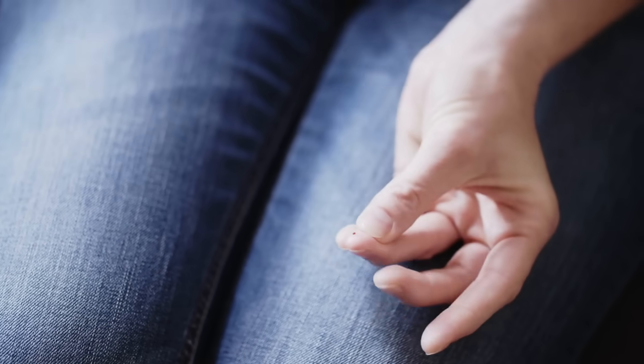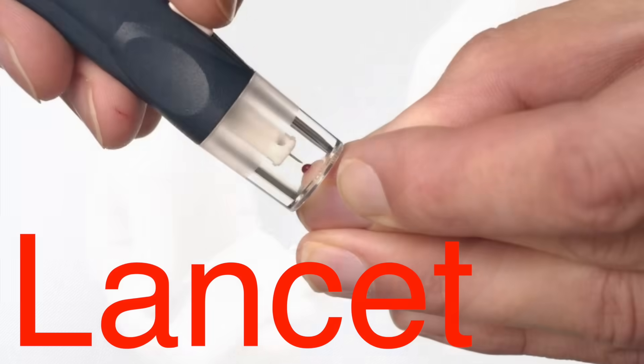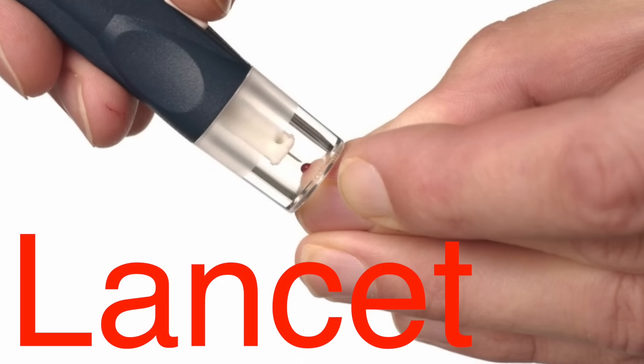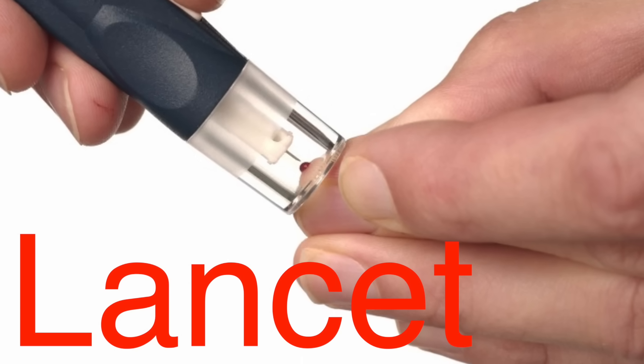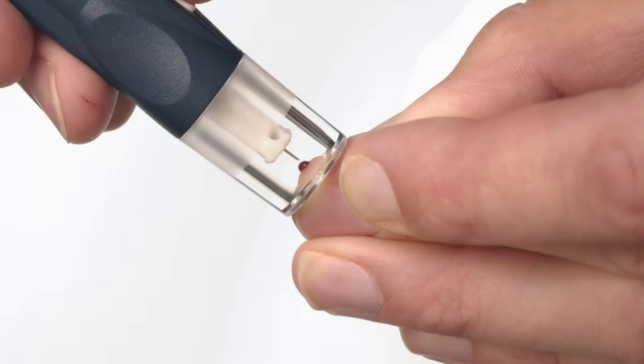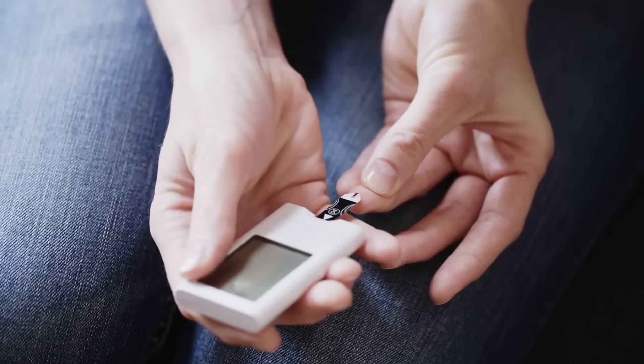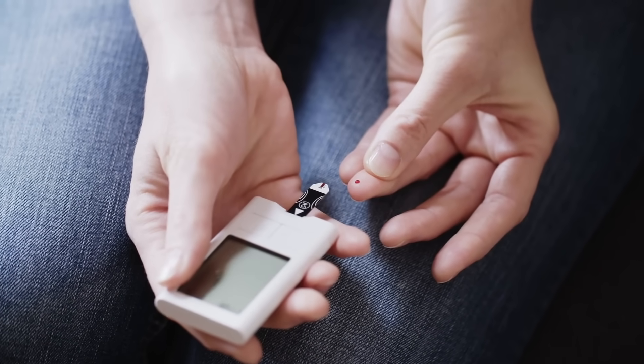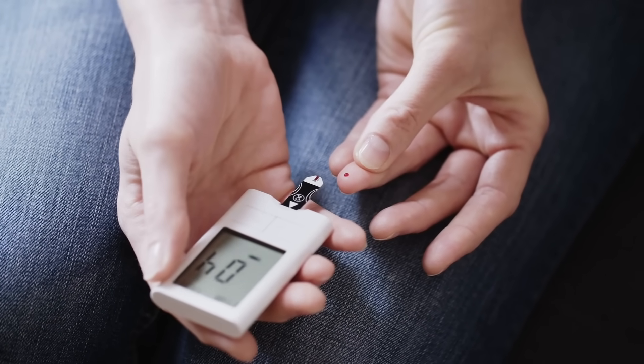Every test begins with a small prick of the finger. The lancet, a spring-loaded needle, makes this part quick and, thankfully, nearly painless. Once a drop of blood is ready, it's placed on a test strip, which is inserted into the meter. That's where the real magic begins.